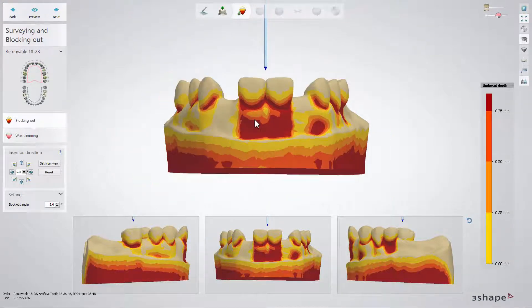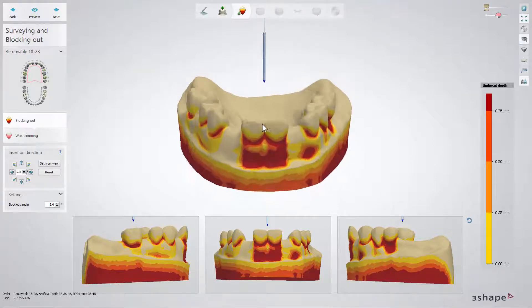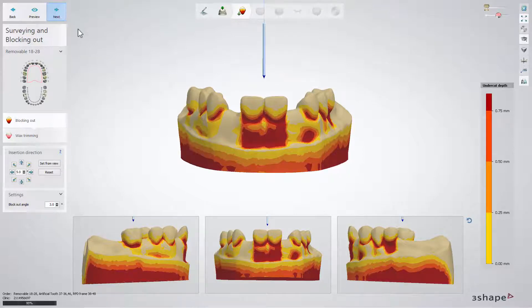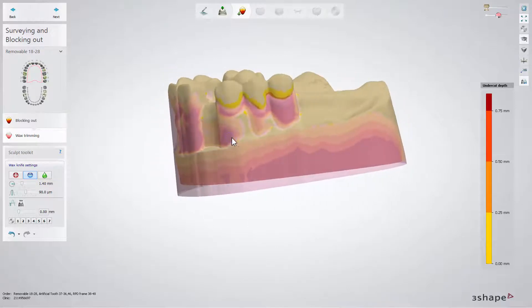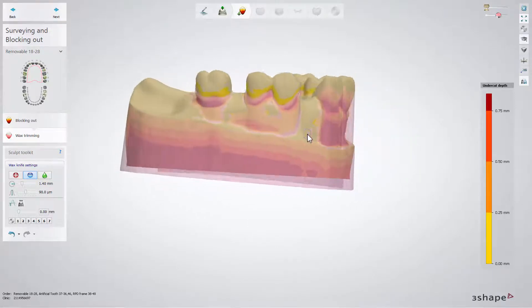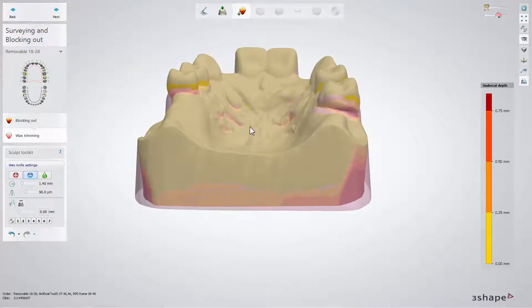In the Surveying and Blocking Out step, you can view the models, make some adjustments and when you are ready, click Next. Here you can add, remove or smooth the blocking out wax, especially in the areas where clasps will be placed later on. After that, click Next.